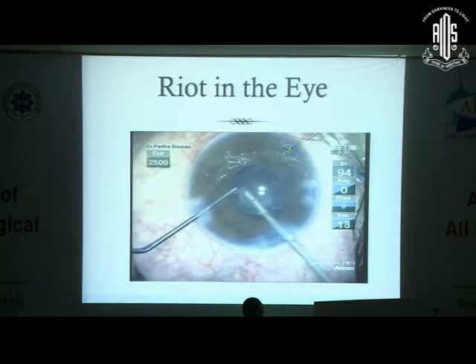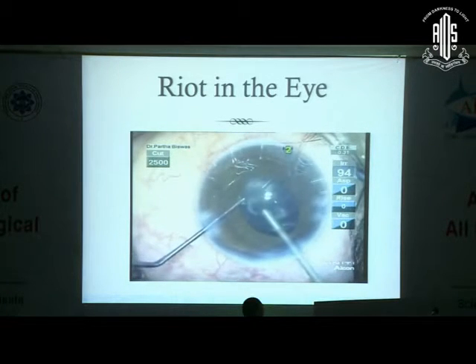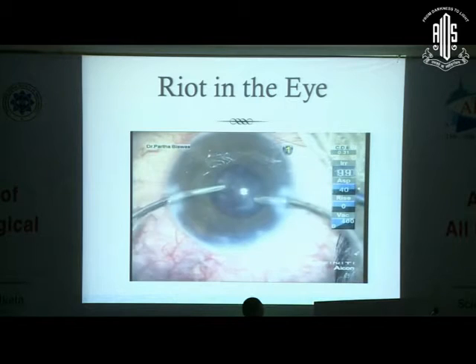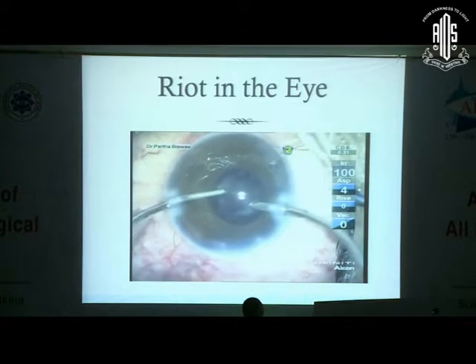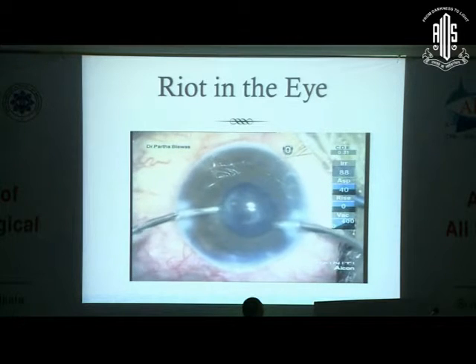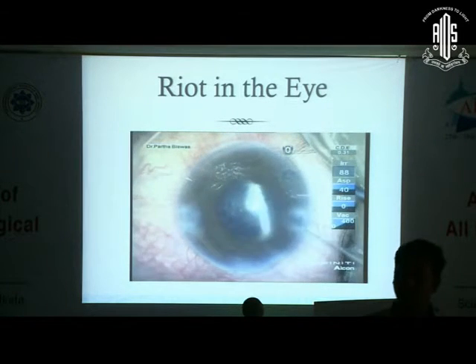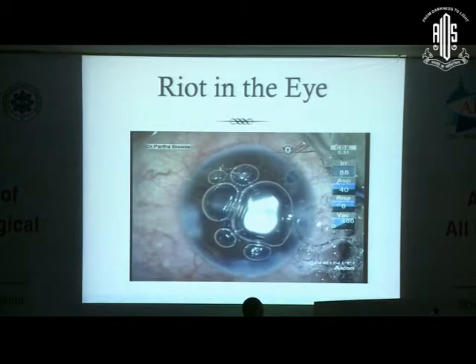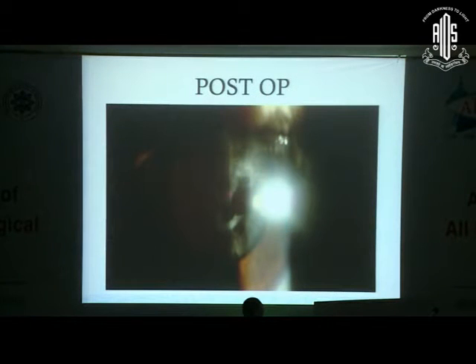I fashioned a small opening in the posterior capsule. Whether this opening would be adequate was uncertain, but we did not want to lose the bag at this stage. I did what I cautiously could and removed the high molecular weight viscoelastic. If the posterior capsule needs to be opened a little more, that can be done at another setting. A YAG laser will not suffice for such a thick plaque. Dr. Rupak's advice was that if a larger opening is required subsequently, we would need to go through the pars plana.